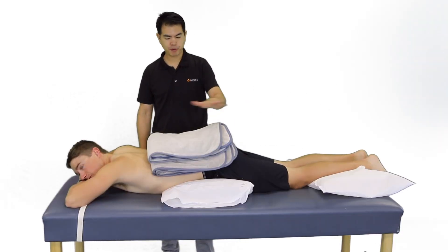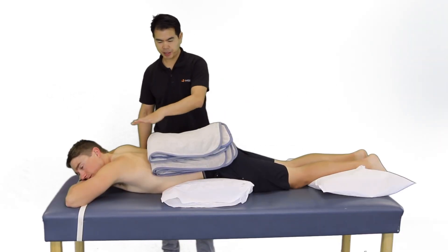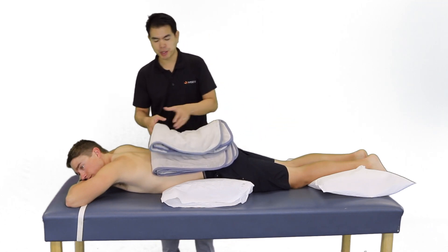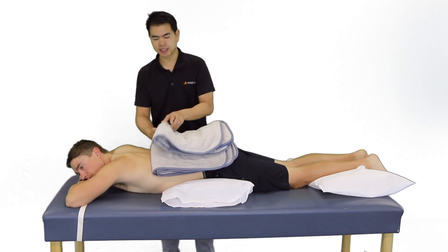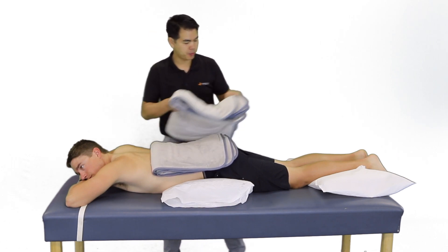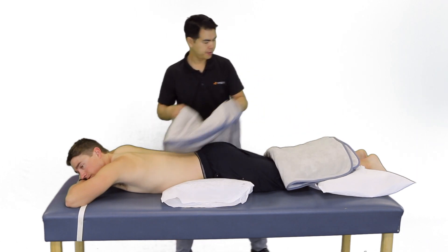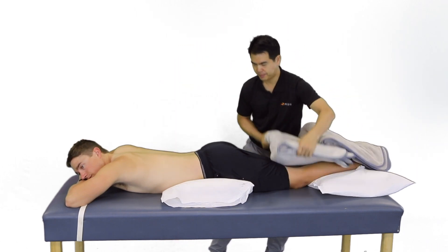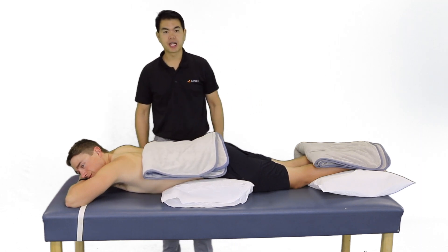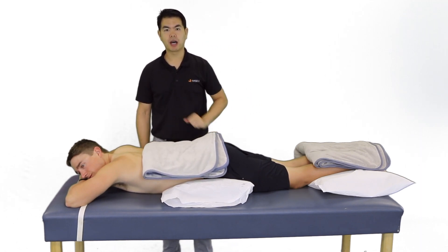If the patient prefers a prone position, we're going to make sure the patient is set up in a comfortable position. We likely need to remove some towel layers because now the patient's body weight is not on top of the hot pack, so I'm going to remove a couple of towel layers. The patient is now set up for a prone position with a hot pack.